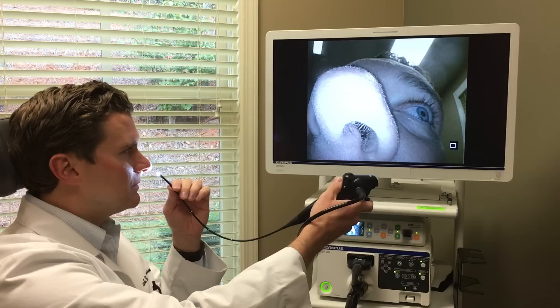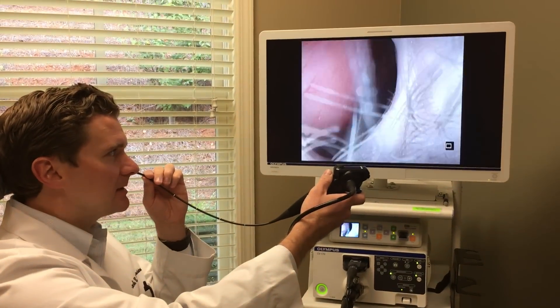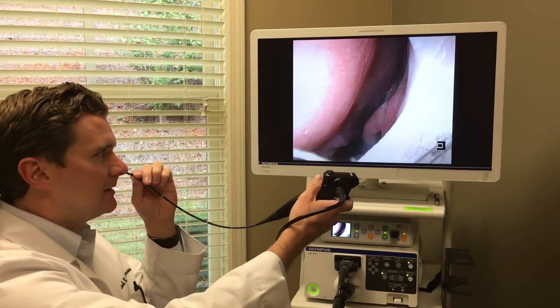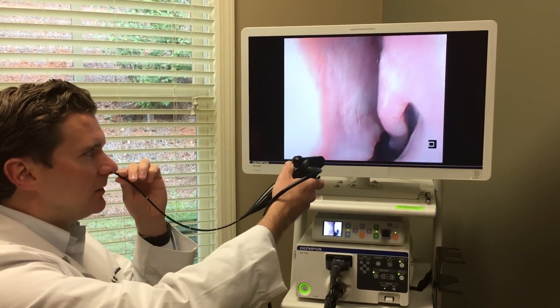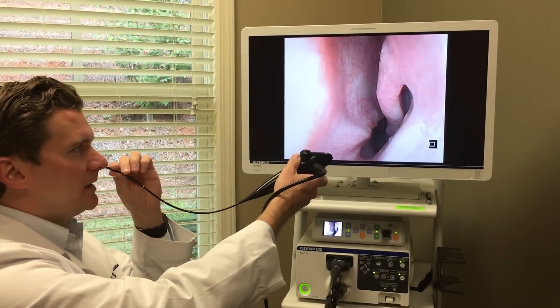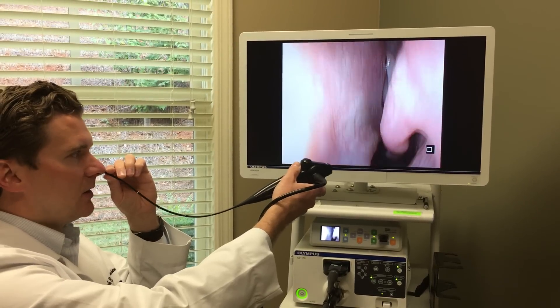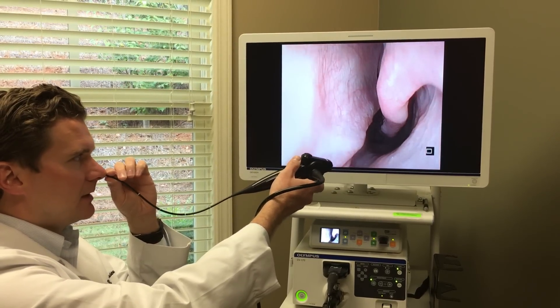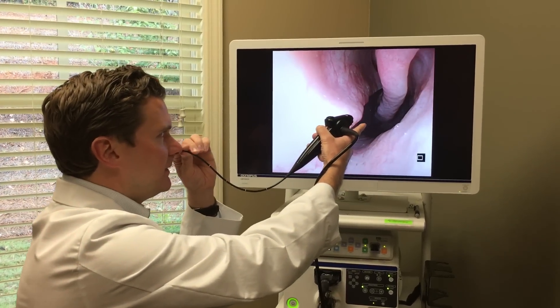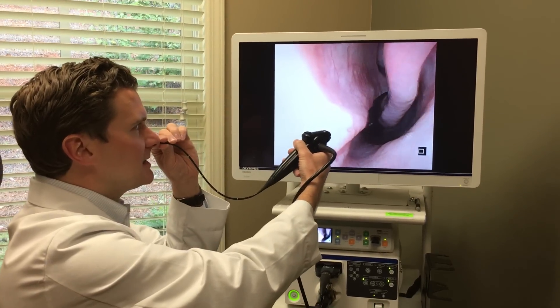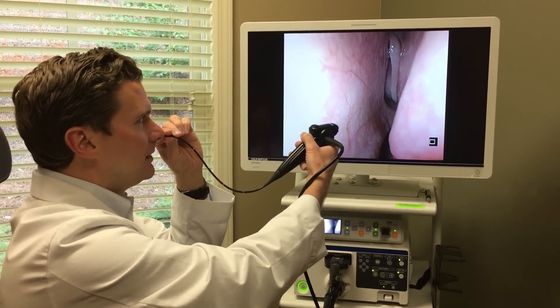When we do this we spray people with a little bit of numbing medicine, which I've had, so it's not uncomfortable. On the left side of the screen you're gonna see my nasal septum. The smaller structure on the right side here, that's called the inferior turbinate. You can see my septum — I actually have a deviated septum, like most people.